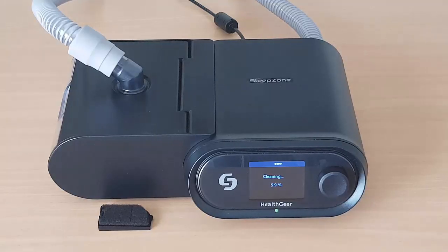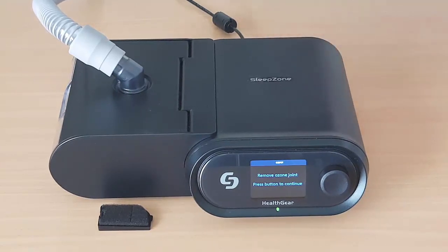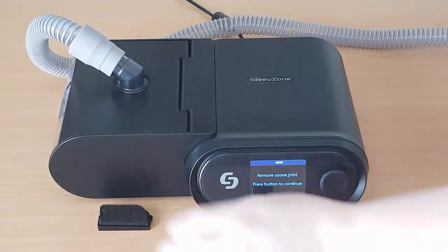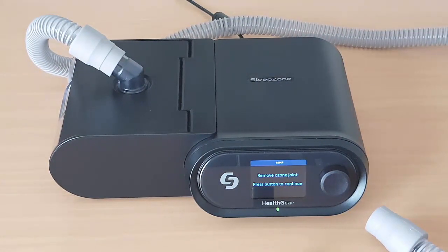When the machine reaches 100%, the cleaning process is finished. It then needs to run for 10 minutes with a fresh air cycle. Remove the ozone joint connector and refit the air filter cover, then press the control dial button and the machine will blow fresh air for 10 minutes.